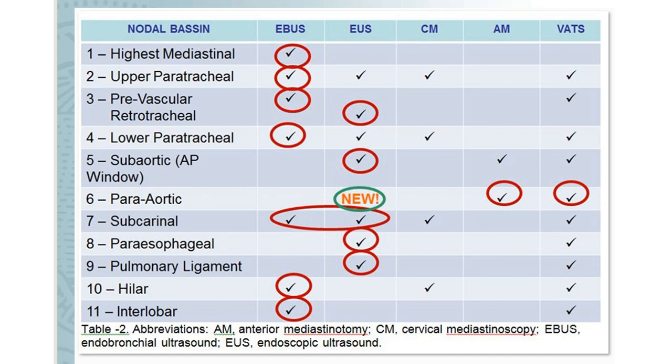I think what's interesting about this technique is that we were previously trained to use mainly the bronchus or the trachea as our route of entry, but you obviously decided let's go through the esophagus and better access these lymph nodes. For the benefit of our audience, maybe let's go into your PowerPoint presentation and you can show us in real time what you're doing, and then we'll come back to some of the questions later.